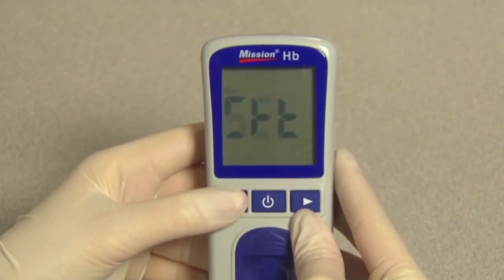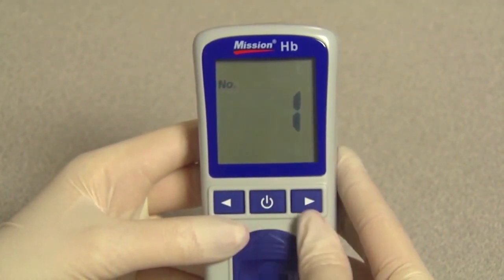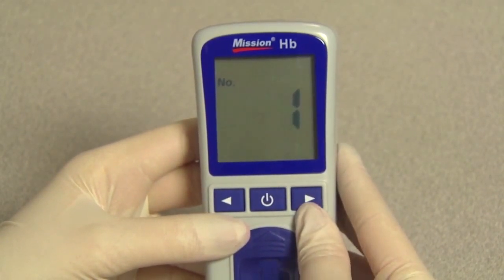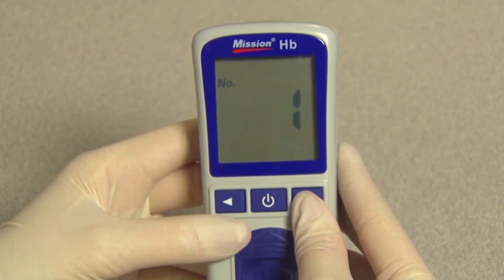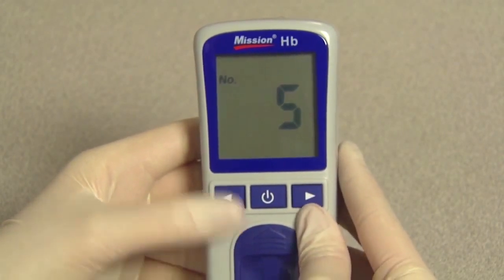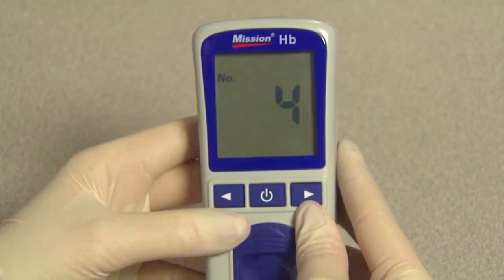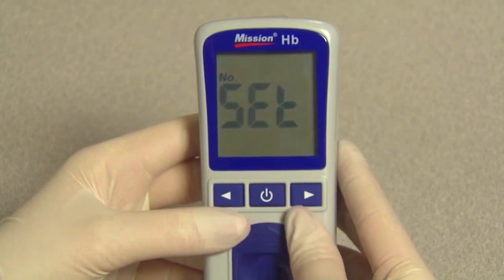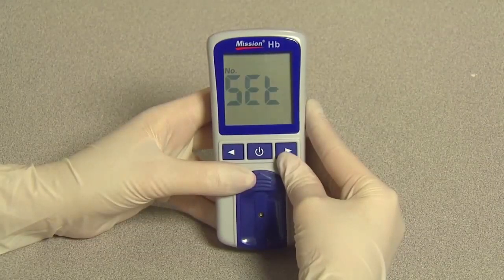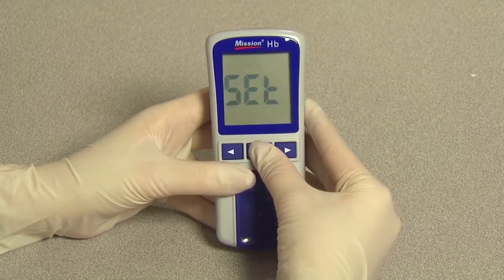From the test number setup screen, press the power button to select the test number setup, in case the user needs to set the test number to a desired number. You can set the test number from 1 to 999 by pressing right or left until the desired number is displayed. Press the power button to save and return to the meter setup screen. Press the right button twice until the system setup screen appears. Press the power button to enter the system setup.